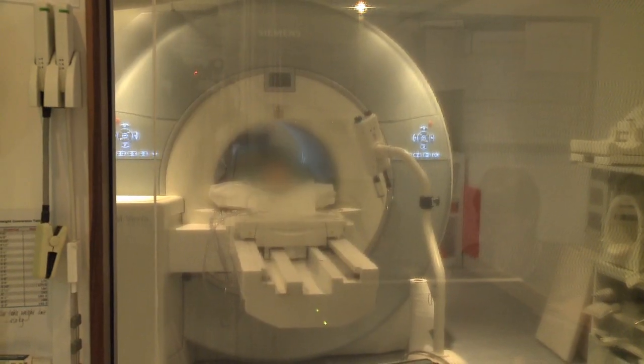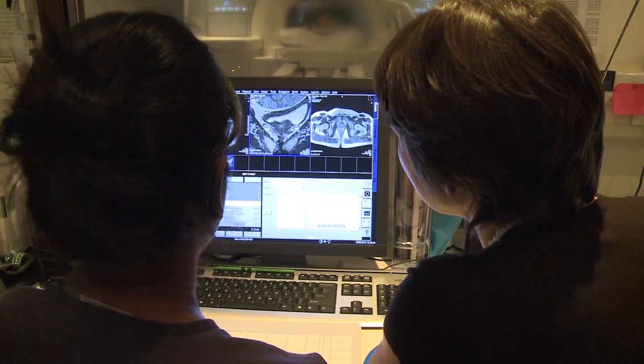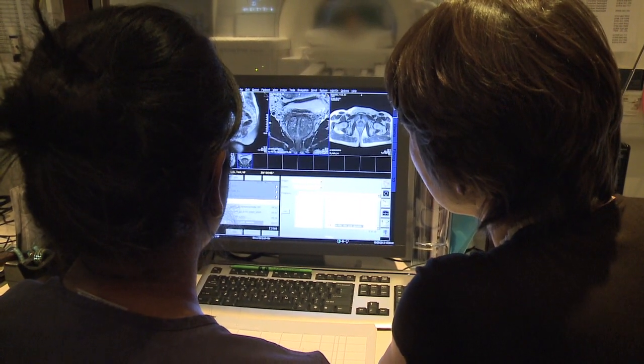My vision of the future of prostate biopsies will be that one will take the biopsies probably in the MRI machine itself. You do an MRI, you identify a lesion, and then you focally destroy it. Of course, that wouldn't be appropriate for all prostate cancers, but for those that are visible and localized, that would certainly be a possible option in the future.